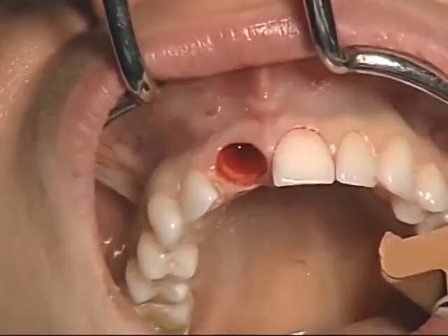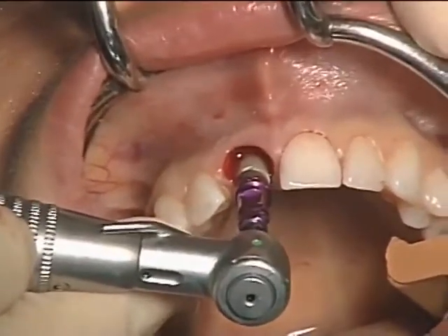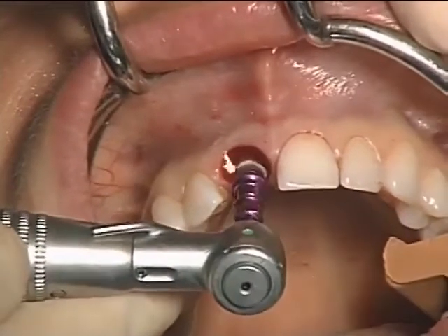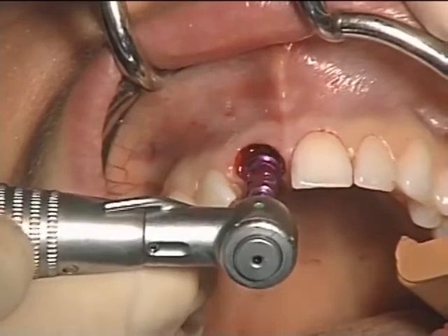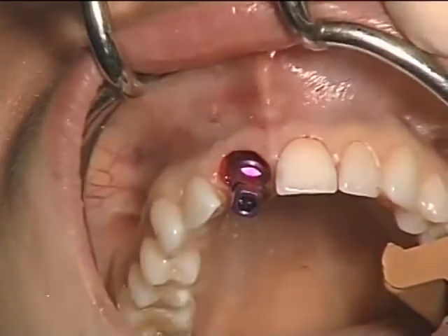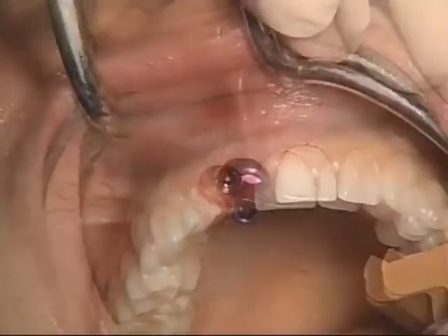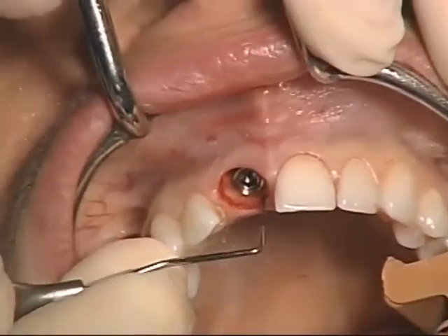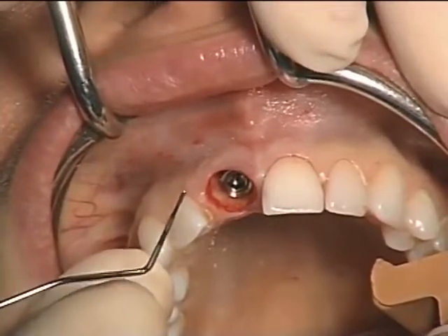Slow speed, non-water irrigation. What we usually will do is stop the implant placement just short of its final position, and then we remove the carrier, go to the ratchet wrench, and the final position of the collar is then done manually, based on the measurements that we made prior to placement of the implant fixture, based off the contralateral tooth readings. Depth of collar placement is now being finalized in relation to the facial height of contour of the bone.